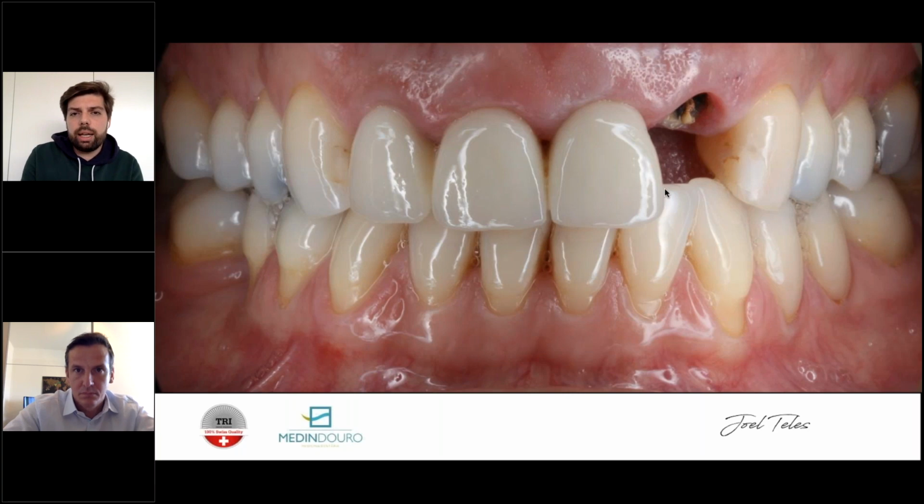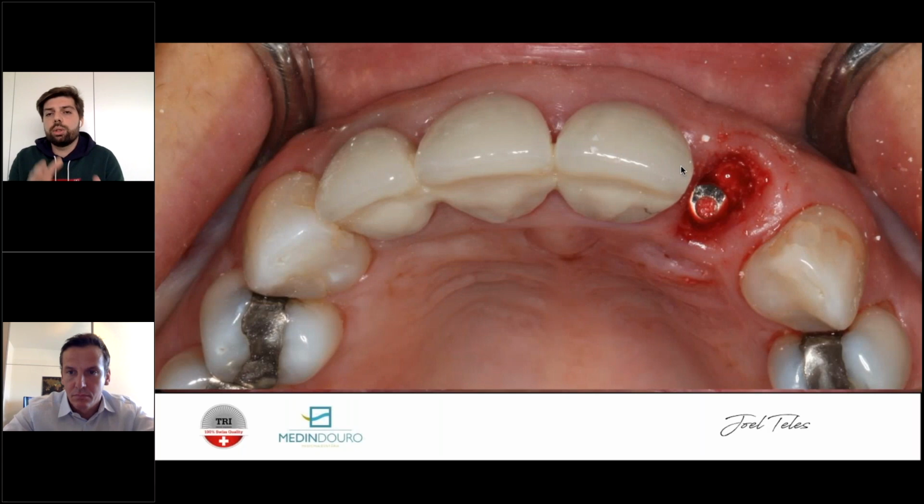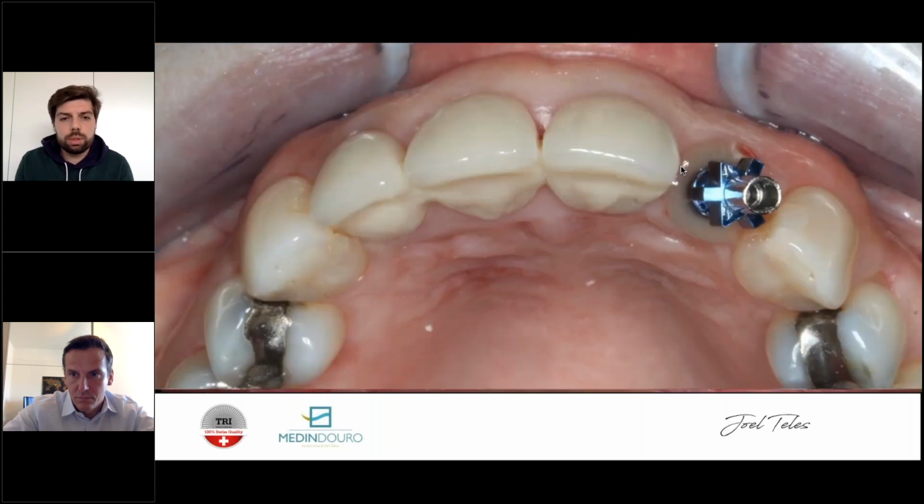This was an old case of mine. I had done 4 crowns here. It was a zirconium bridge, and this tooth had an idiopathic resorption and had to be extracted. So I cut the frame of zirconia carefully, not to damage the ceramic. And even though I did everything like I just told you, placing the implant in the right position, touching the palatal wall, even so, sometimes in laterals this might happen.